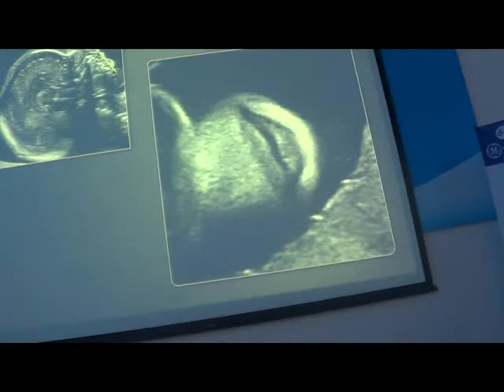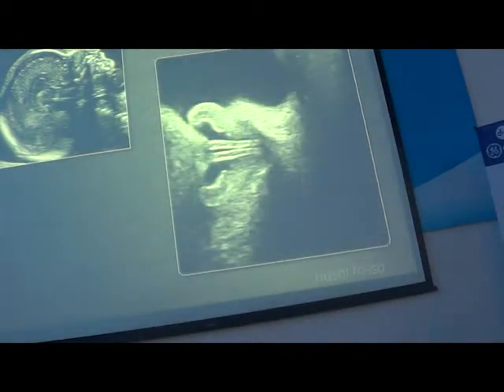And this is a view of the upper lip and the lower lip. And with this, if it's normal, you can exclude a cleft lip. This is the nose with the nostrils, the nasal fossa and the septum.